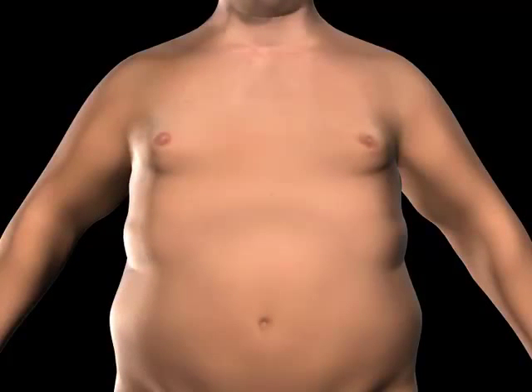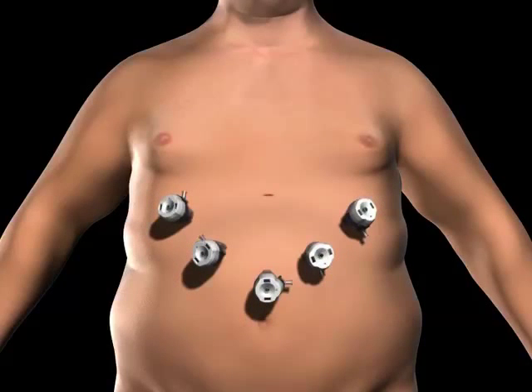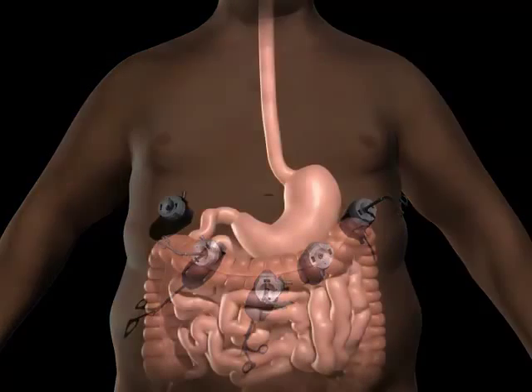To gain access to the abdominal cavity, small incisions are created on the abdomen. Trocars, which serve as passageways for the surgical instruments, are placed into the incisions. The surgical instruments are passed through the trocars to access the abdominal cavity. The surgeon examines the abdominal cavity using a laparoscope or video camera.